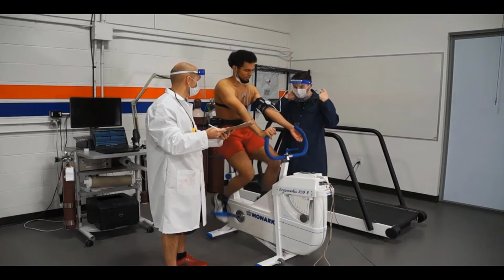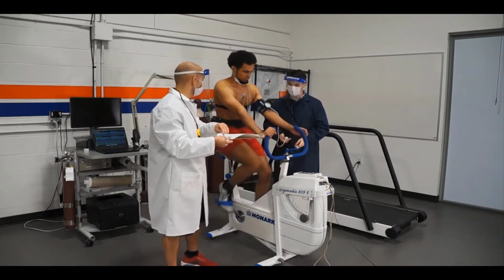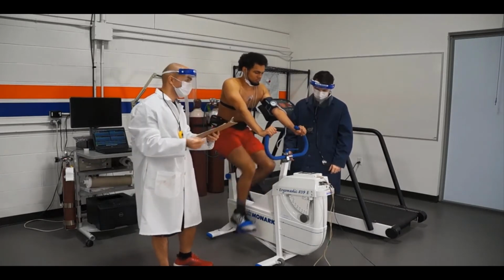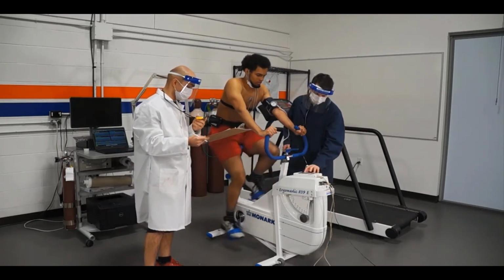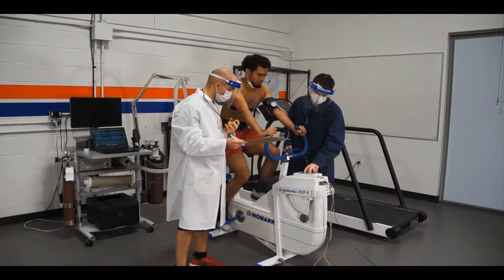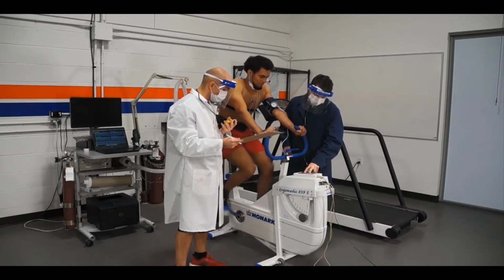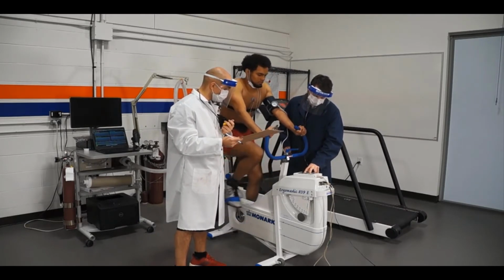So you can see that at the end of that 2 minutes, Nick and I both move in. He palpates heart rate and I take blood pressure. And really, indirect tests are just time management, making sure that you're monitoring how your participant looks, how comfortable they're feeling, and then get all these measures in 10 seconds at the end of each stage. That's really all, I can't stress enough. It is managing those 10 seconds at the end of each stage, not bleeding into the next workload, not frying 30 seconds off your next workload or extending your current workload 30 seconds too long because you couldn't get a blood pressure in.